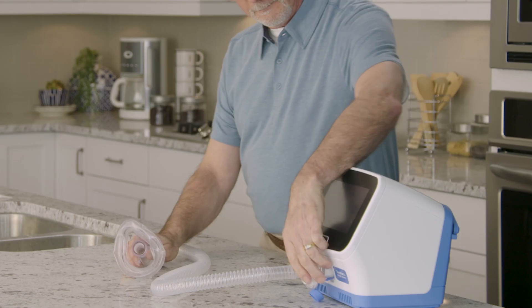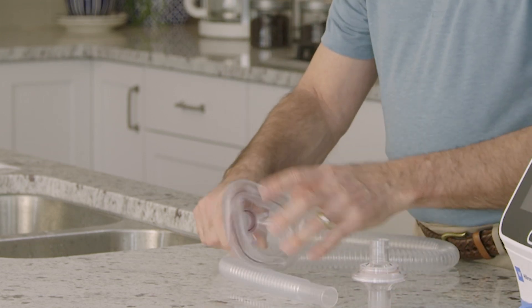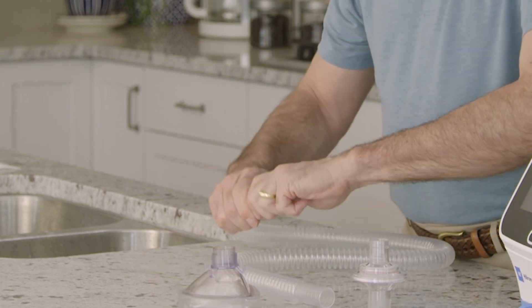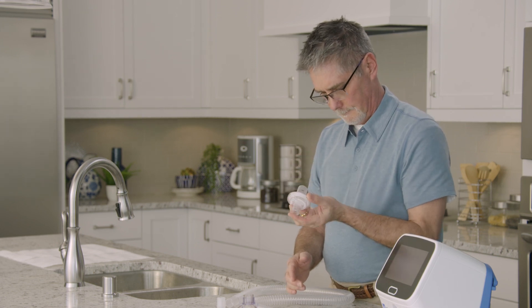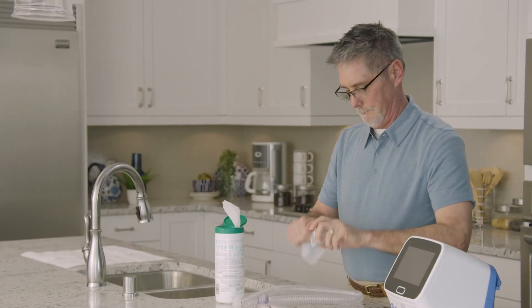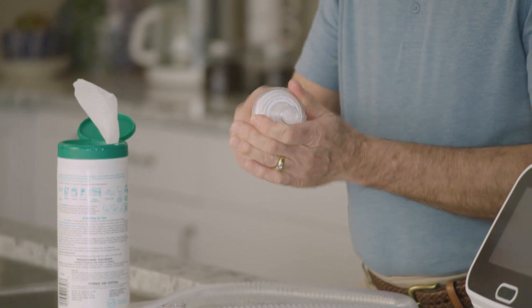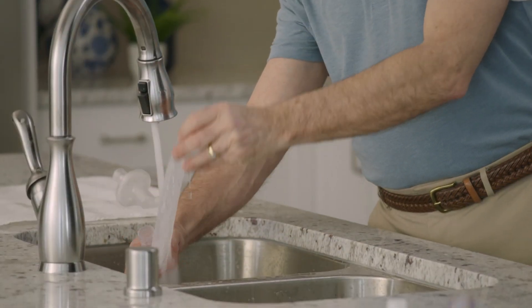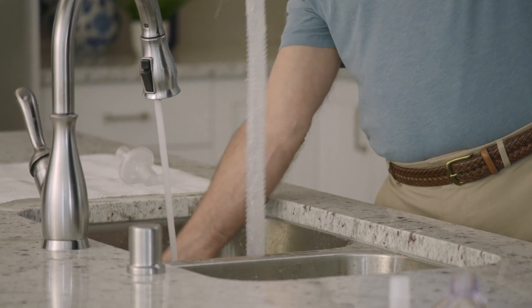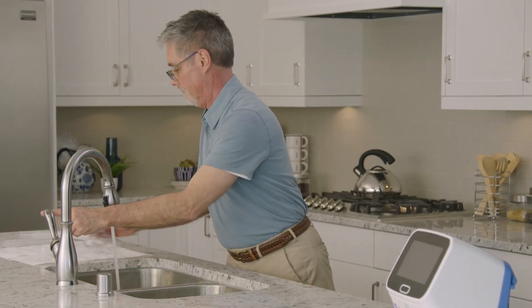To clean the single patient use circuit, disconnect the circuit from the control unit and then disconnect all components. Examine the inside of the smart filter; if it is damaged, visibly soiled, or wet, replace it. Only wipe down the outside of the smart filter with a compatible cleaning solution; do not soak or wash the inside. Wash the other components of the patient circuit — excluding the smart filter — with warm soapy water. Let the components dry completely, then reassemble the circuit.